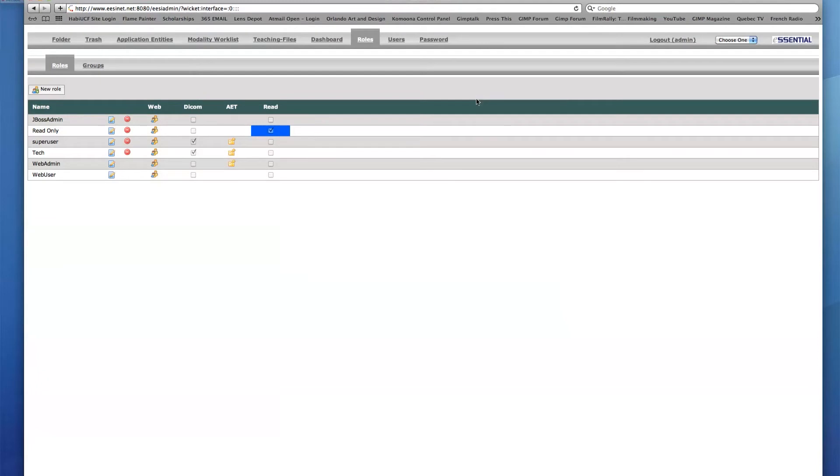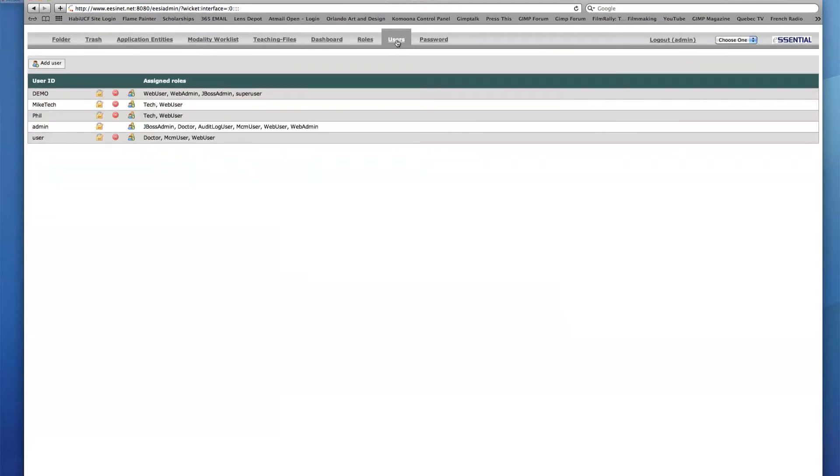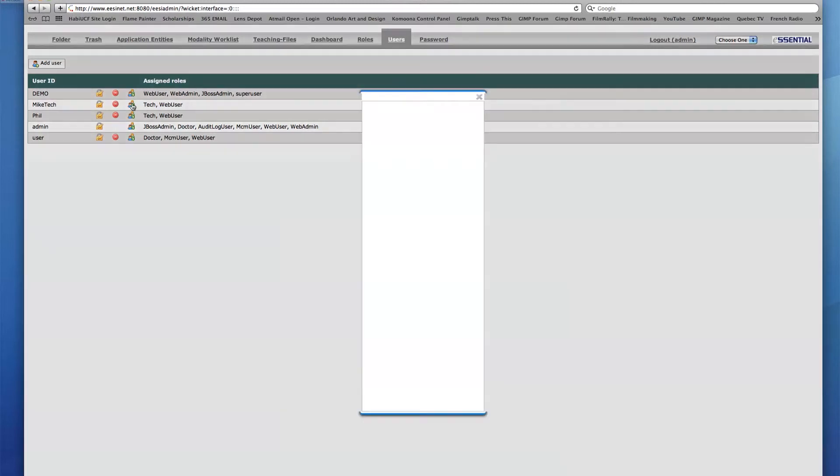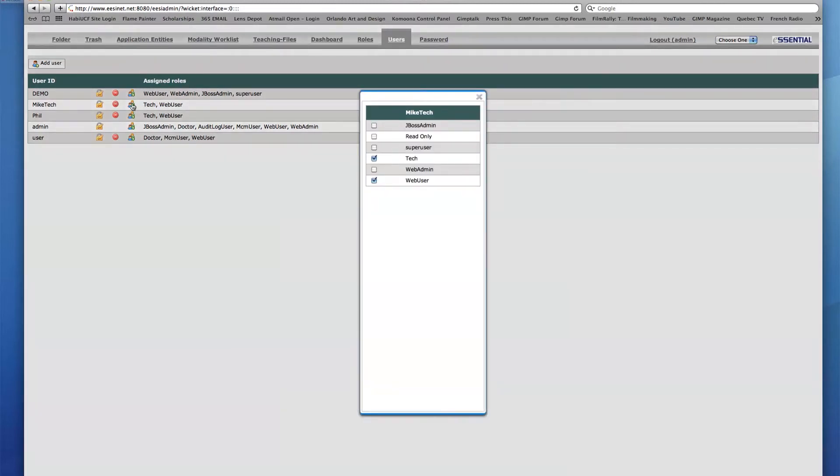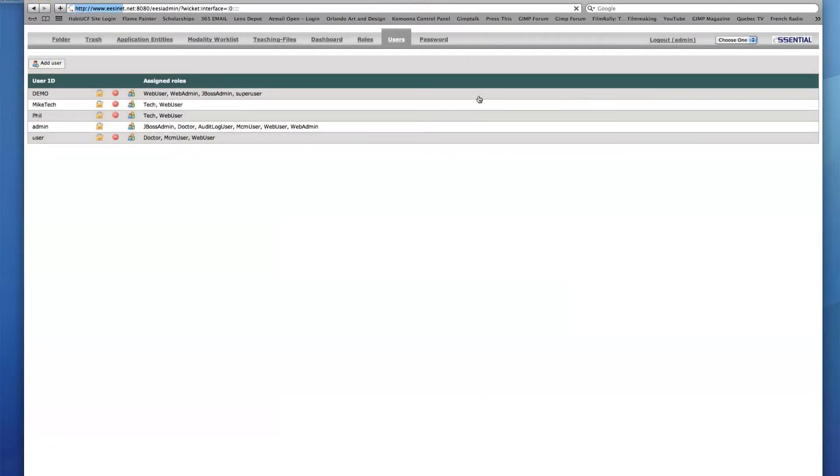Next, I'll go back to the Users tab, come down to Mike Tech, click the Manage Roles icon, and enable the new Read Only role. The new role is now added to the Assigned Roles area next to Mike Tech.